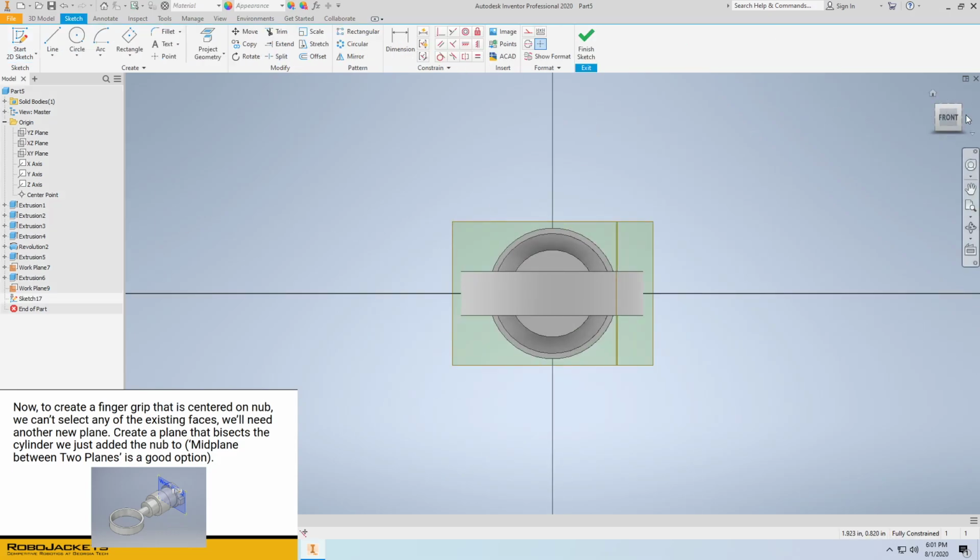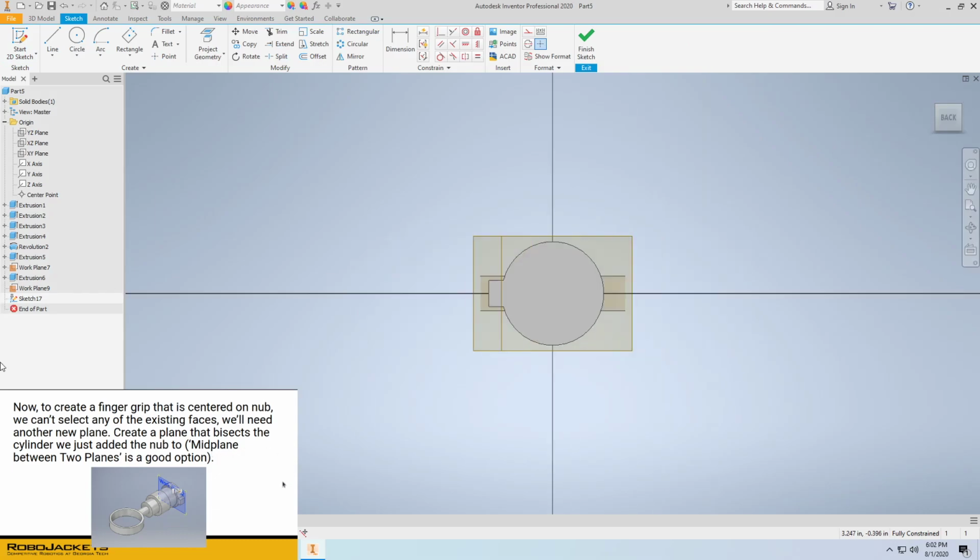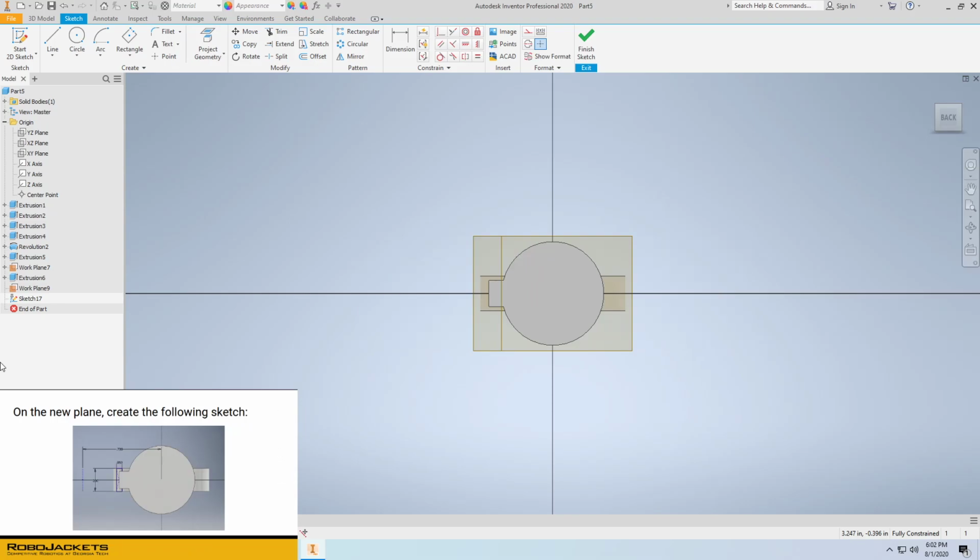We'll head over to the other side of the part because it's easier to envision it from here. And we'll create the sketch given to us. I'm using the midpoint 3-point rectangle tool, creating one with 0.2 height and 0.05 width. Here we go.